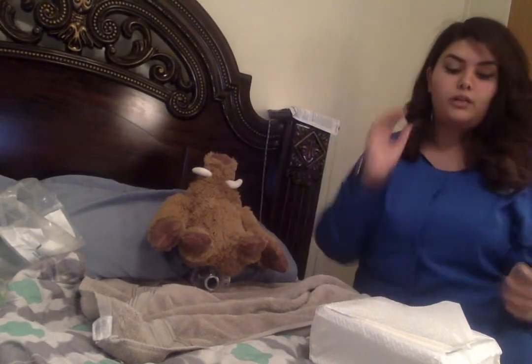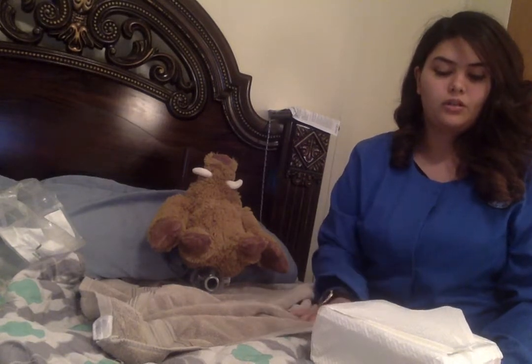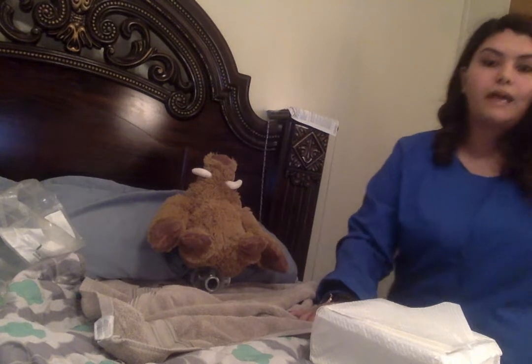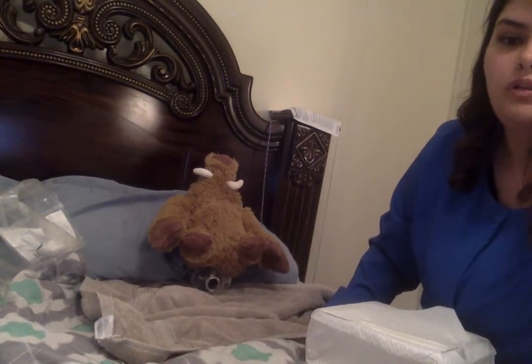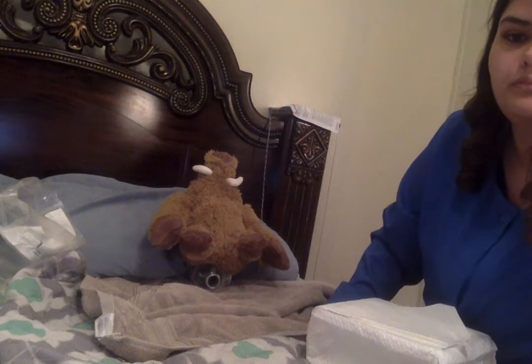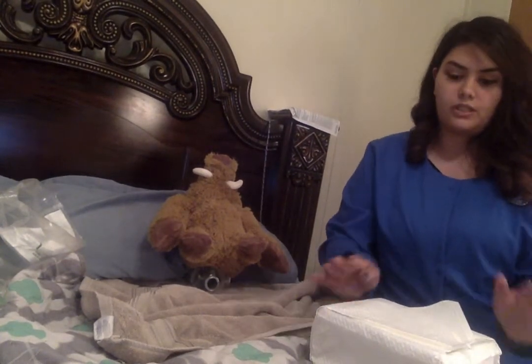And now we are going to open our, what is this called? Our catheter kit. I don't have a bedside table, so we're just going to do it on the bed, but if I had a bedside table, we'd be doing it on the bedside table.